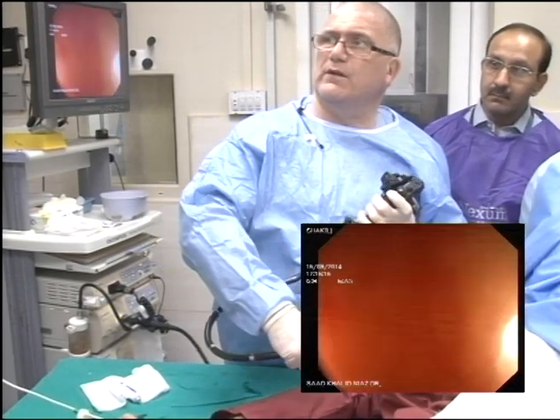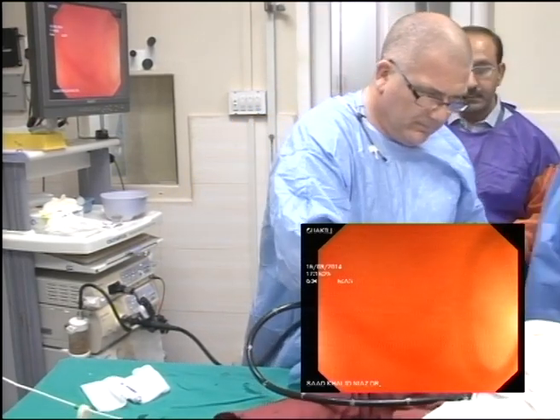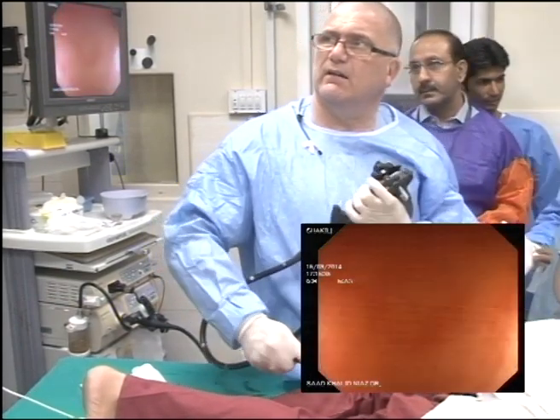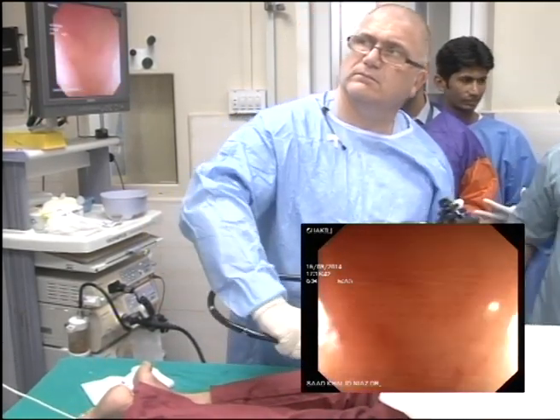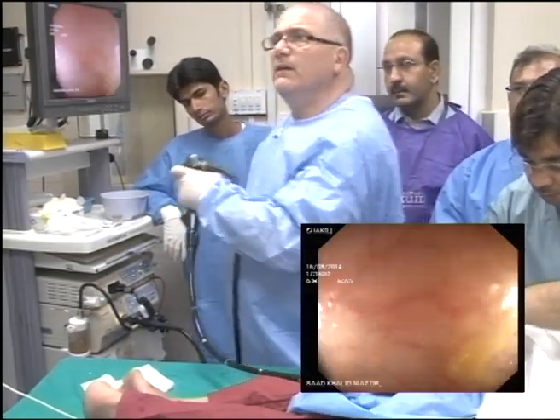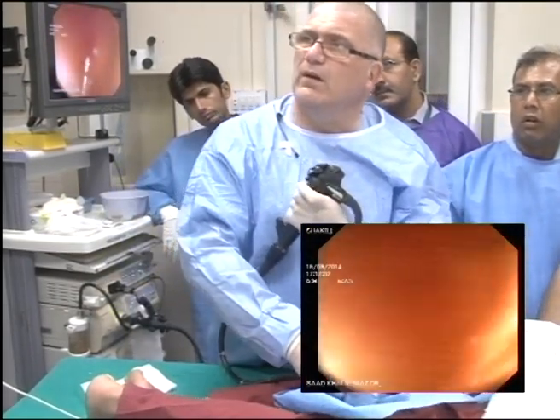So what we've done is change position so he's onto his tummy. Scope is possibly coming anterior, so I'm actually coming back with it. I want to make the scope feel comfortable. Onto your tummy, hip square to the bed. If you notice now the scope staying static. And we've just freed up the scope now. Point the buttons over to the wall, have a little look.